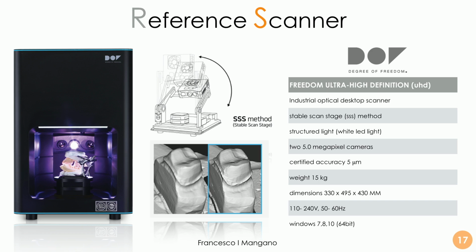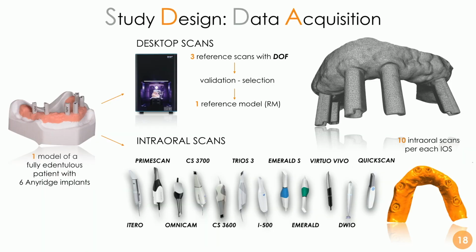And then we captured different models. We chose one model, the best among all these models, and we considered it as a reference. And then I captured in person 10 scans with each one of these different intraoral scanners in order to generate around 120 models from the different intraoral scans, and then we superimposed, we compared basically all these models with the reference model by means of a reverse engineering software.